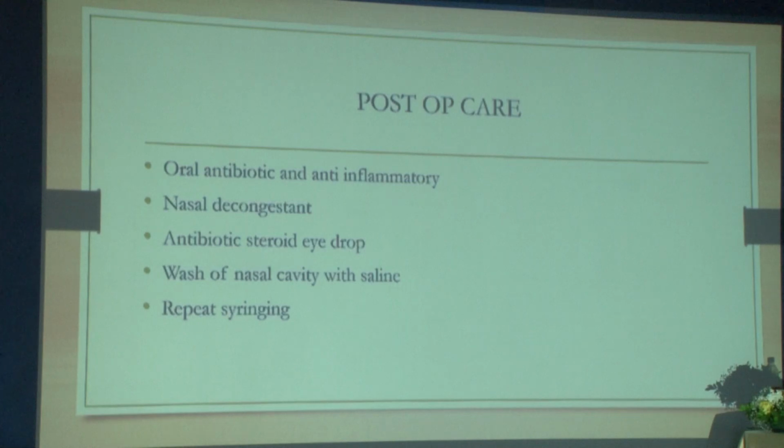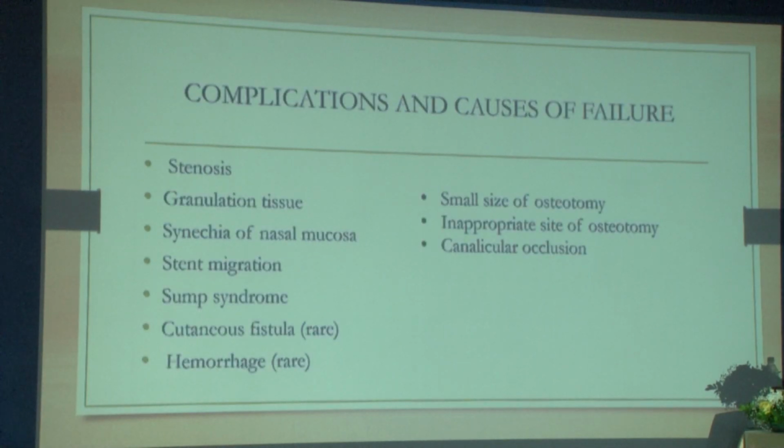Post-op care should be taken: oral antibiotics, anti-inflammatory drugs, nasal decongestant, and topical antibiotic-steroid eye drops should be given. Washing of the nasal cavity with saline should be done. Repeated syringing may sometimes be required. Complications and failure: every surgery has its own complication and failure rate. In laser surgery, it causes stenosis and granuloma formation.